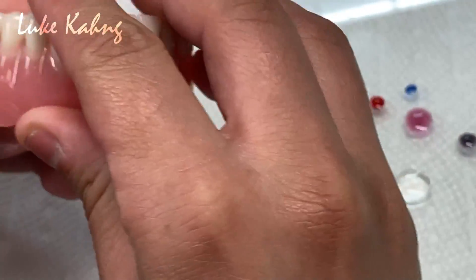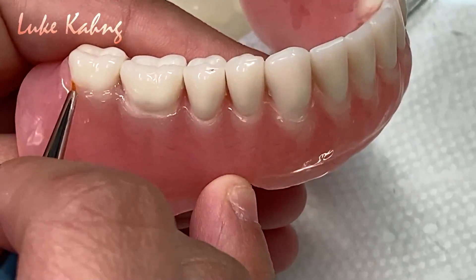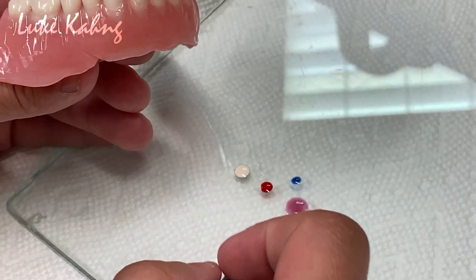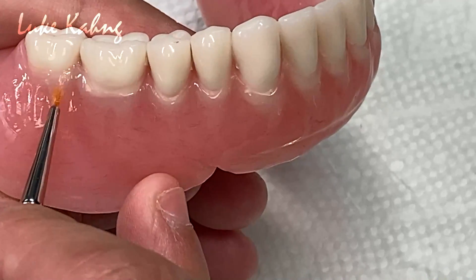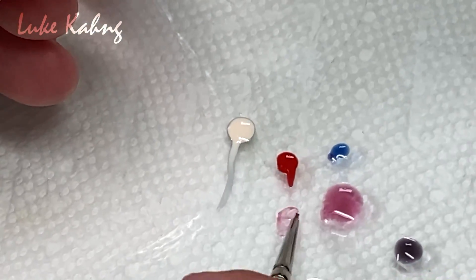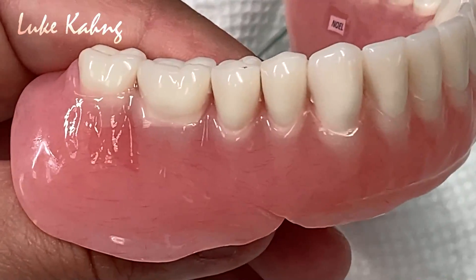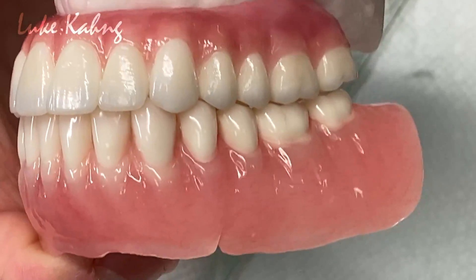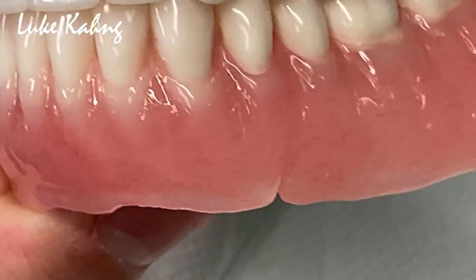Here's what we can do. Here's the denture, we finish this after process. Then I apply with the glazing. I cut two sticks on the other side. We recreate the texture.